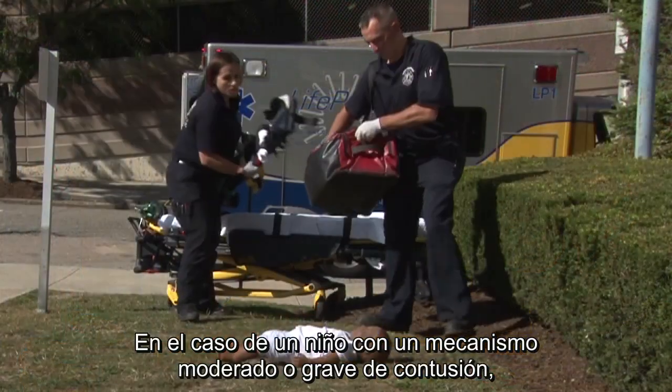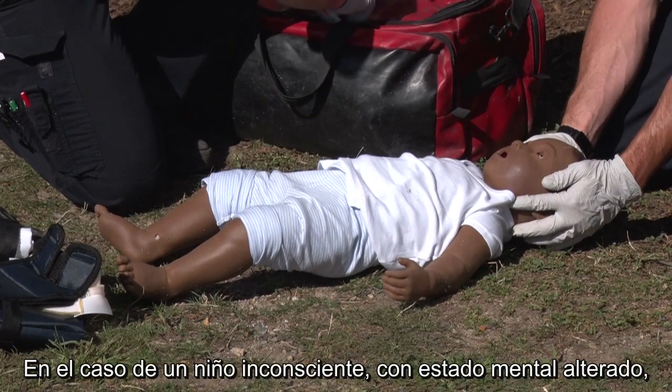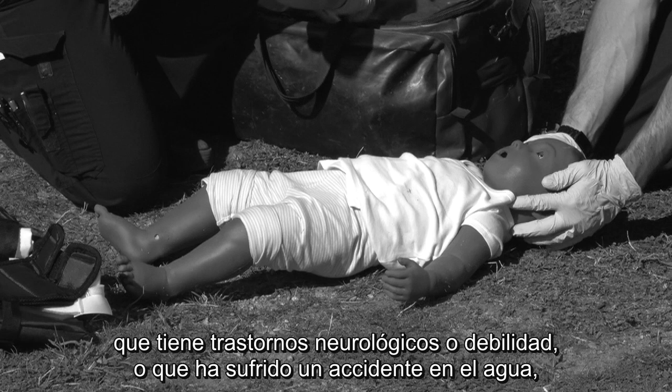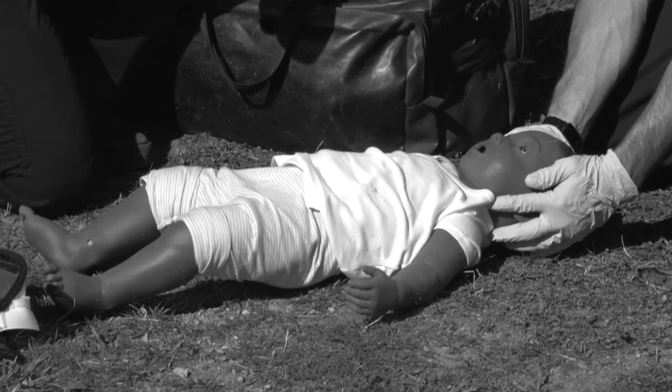For a child with moderate or severe mechanism of blunt trauma, assess the need for cervical collar. For a child who is unconscious, has altered mental status, is complaining of neck pain, has experienced a high-energy mechanism of injury, has neurologic deficits or weakness, or a diving accident, proceed with application of a cervical collar.